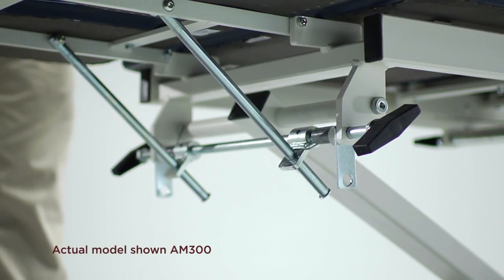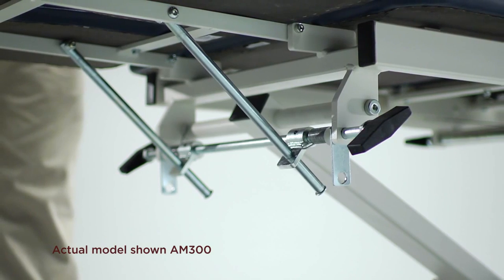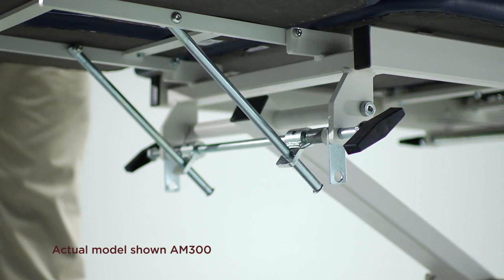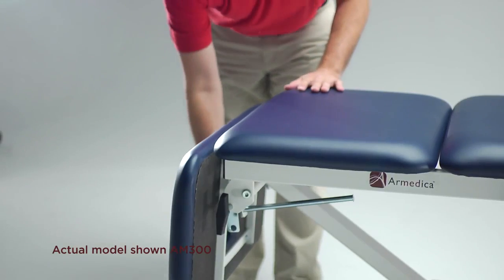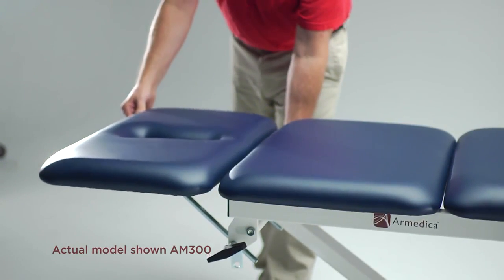Another feature common to most Armedica tables is our double support friction lock system that assures the patient is safely held in the desired position until the lock is released by using the release knobs on either side of the table. Note that it is not necessary to use the knob when lifting the section, only when releasing the locks to lower the sections.